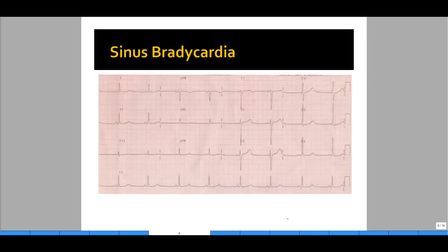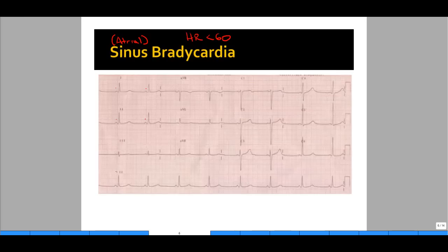Next is sinus bradycardia. We need to identify it by: one, is this sinus or atrial in origin, and two, is the heart rate less than 60? Is there a P before every QRS? Yes. Is there a narrow complex QRS? Yes, the QRS is less than 0.12 seconds in width, or three small boxes. Next, we need to identify if this is bradycardia. Look at the number of large boxes between each R wave — there are about six boxes, so you would call this a heart rate very close to 50.